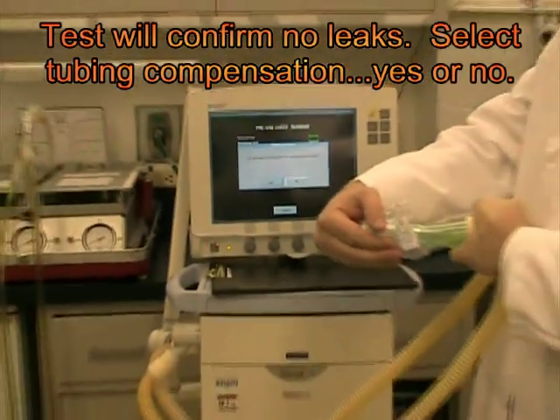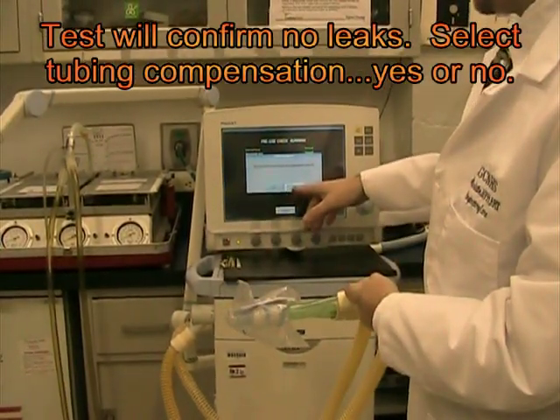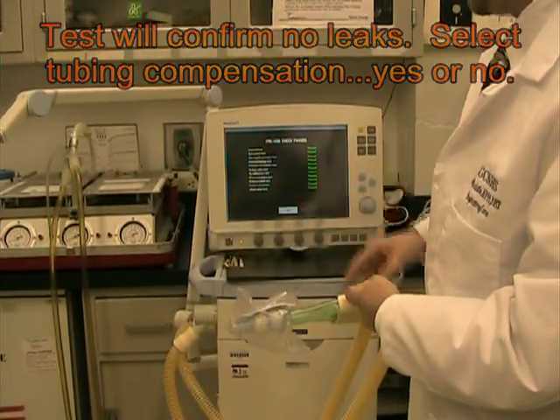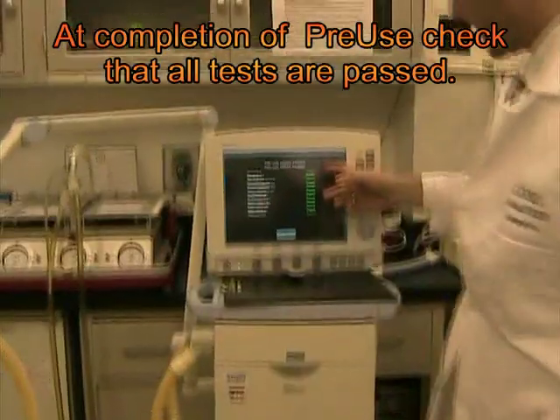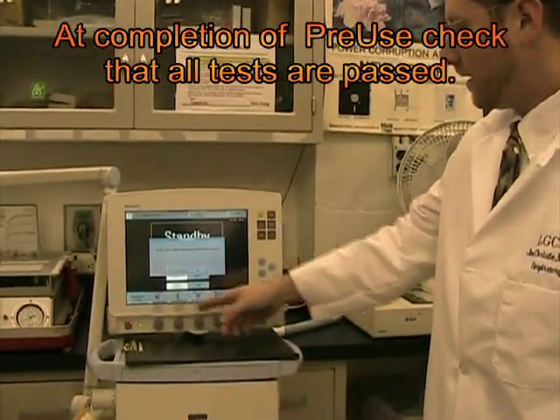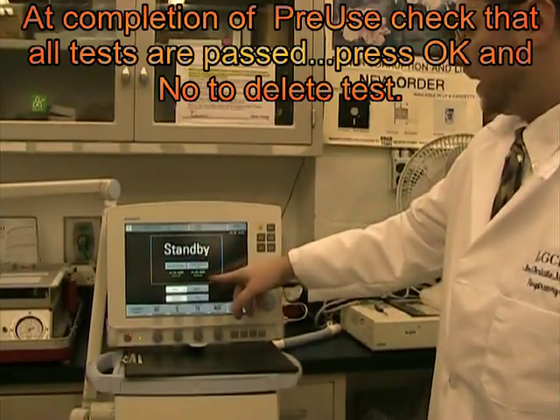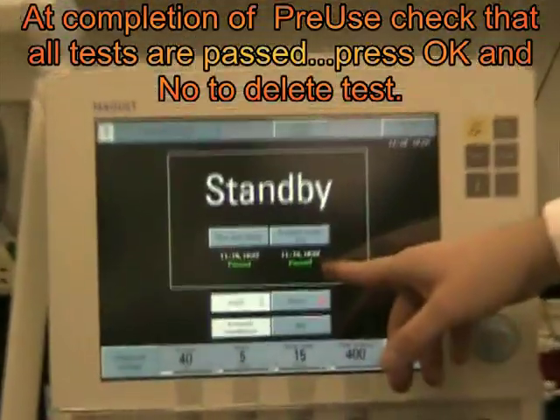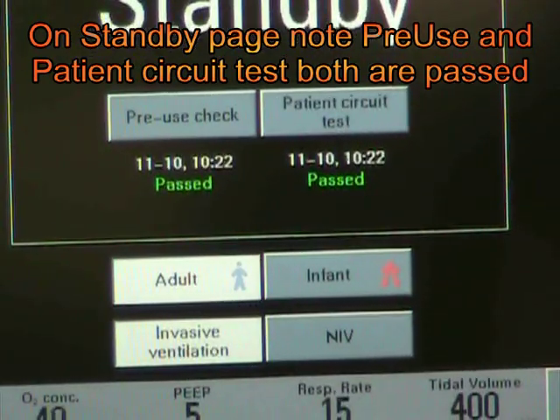Let's do a circuit check. That check verifies the integrity of the tubing and we will not compensate for volume lost. As you can see on the screen, all tests are passed. We'll click OK — we will not delete — and you can see pre-use check passed and patient circuit test passed. That concludes the pre-use check on the Servo I.